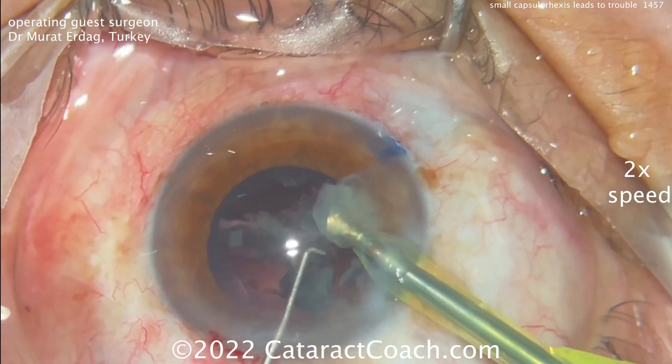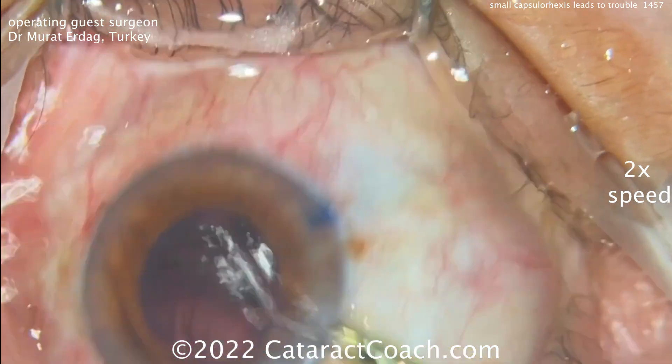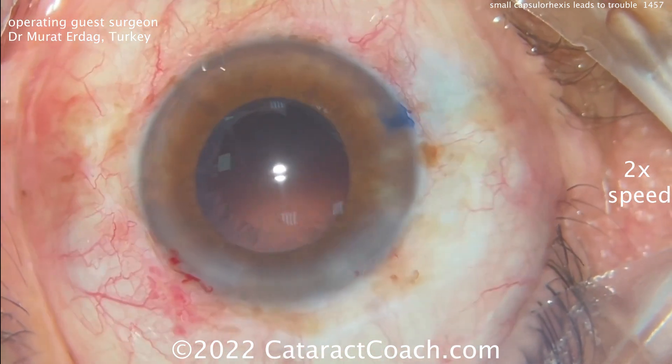As the last nuclear piece is removed, we notice a runout. Look at that — right under the phaco probe in the sub-incisional area, the Rhexis has run out or split pretty widely.